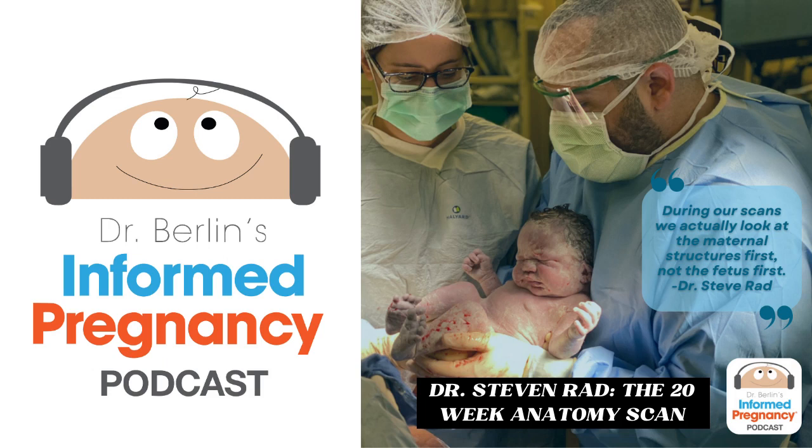Then we'll move down to the fetal chest and we'll look at the chest appearance and size. And in the chest, we look at the heart. And like I said earlier, we double check the situs or the position of things and make sure the heart's on the left side of the body. And the heart has 4 chambers and it has outflow tracts. So there's a lot of connections between the heart and the valves. To make a long story short, we make sure the heart is pumping well, its structure and function, its position, the heart rhythm, all that looks beautiful.